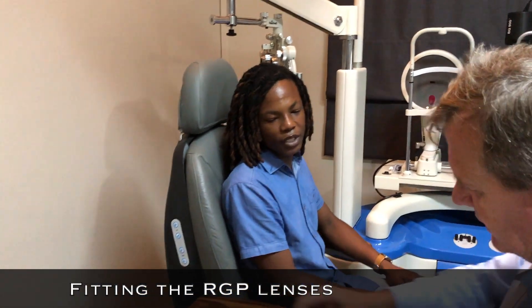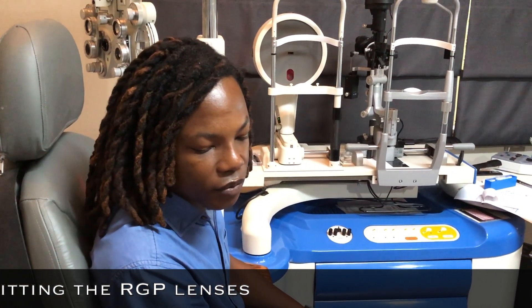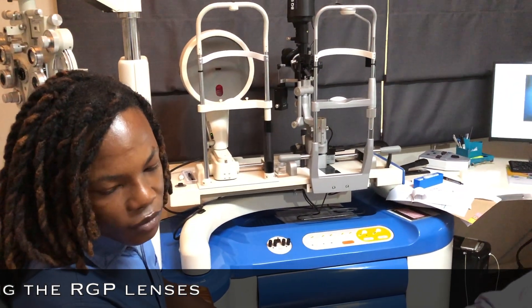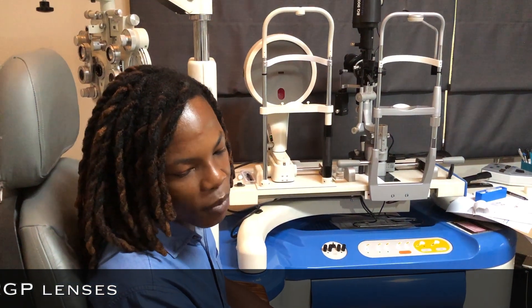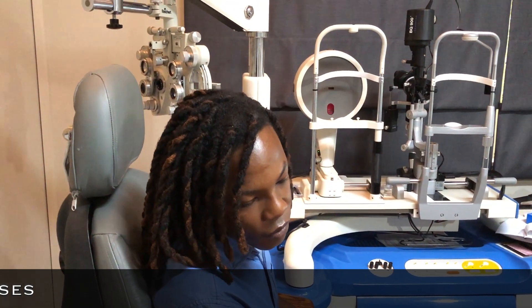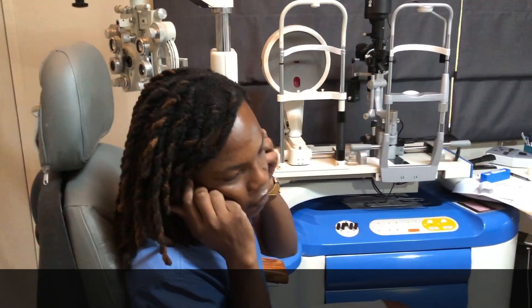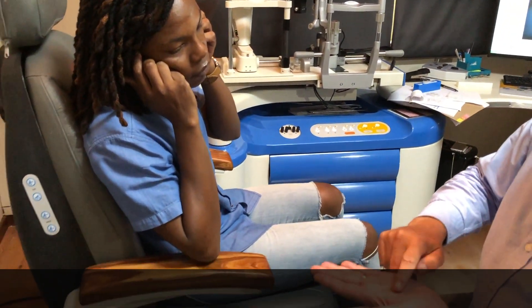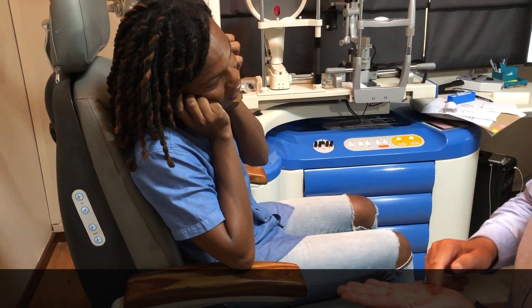That's why it's called a rigid lens — an RGP lens. People call them hard lenses, RGPs, or corneal lenses depending on where you are in the world. It's all the same thing. Now the other ones that have become more popular are the scleral lenses, because they're supposedly a little bit easier to fit. But these RGP lenses are healthier. So if you can tolerate this and you can see with this, you will be very happy with it.